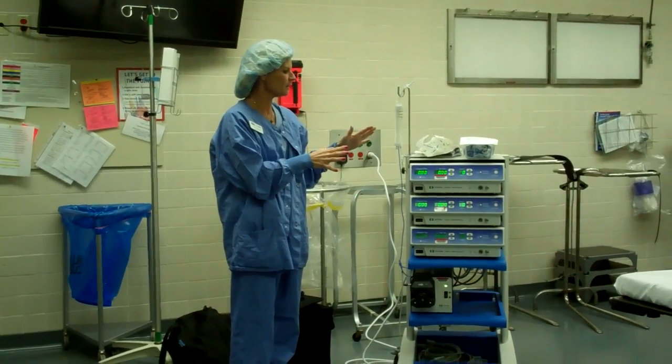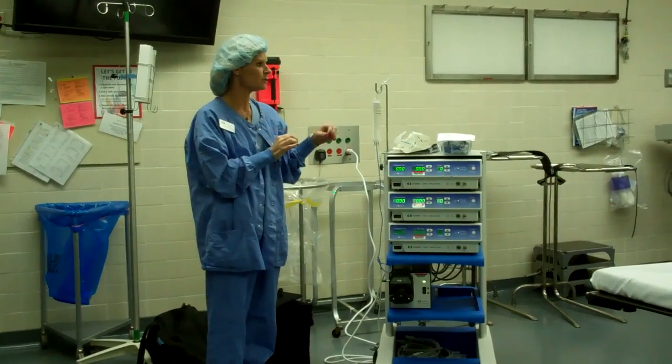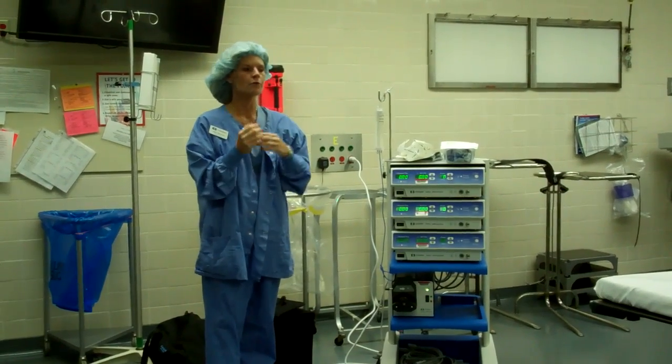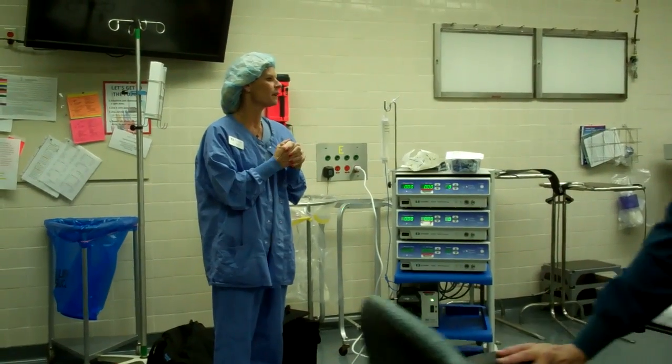I'm going to go through this, showing you an open surgical procedure because the antennas are different, and then a laparoscopic one. Dr. Cheng uses both, and it's also used by Dr. Apobea in conventional radiology.